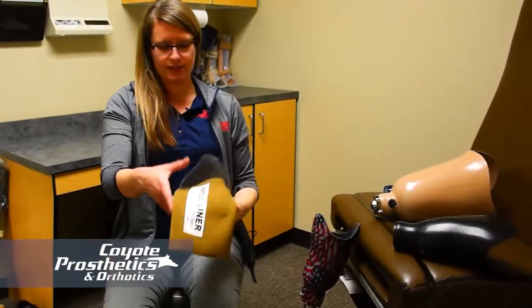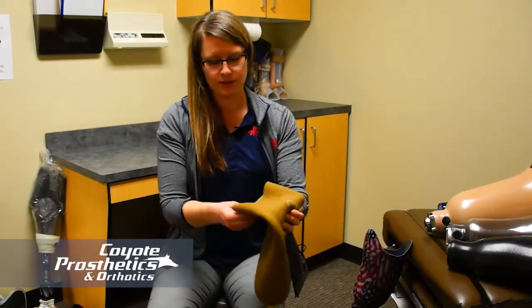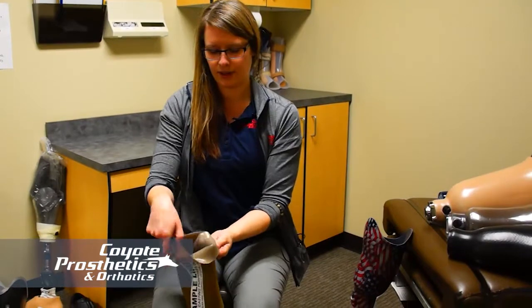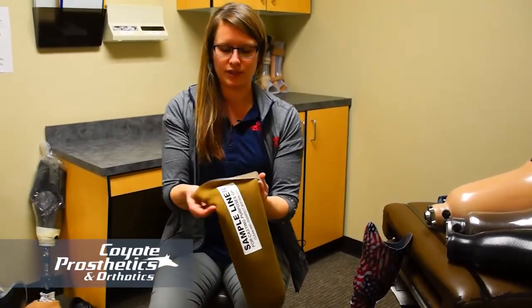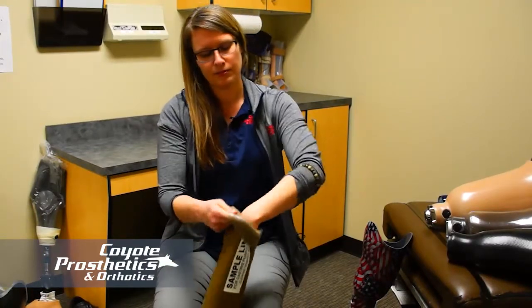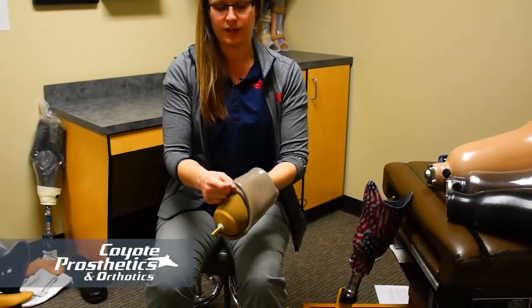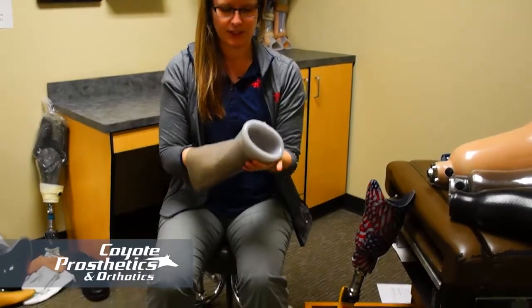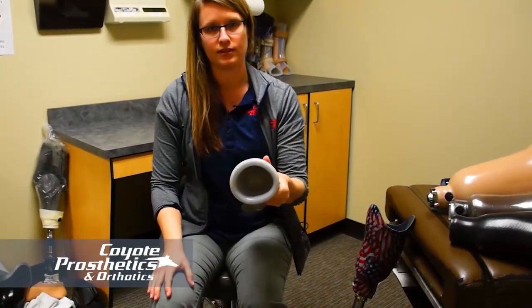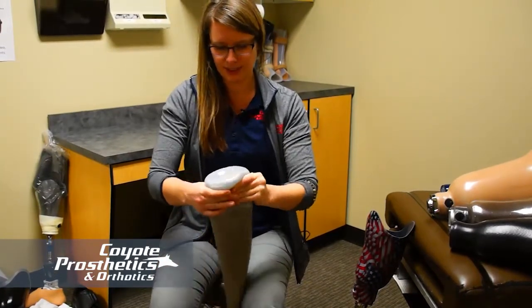First we are going to start with how to put your liner on. Most times you will have a prosthetic liner, and that's what this is called. They come in all different colors, there are different types. But generally what you're going to want to do is turn this inside out. You want to turn this all the way inside out. Here, you can see there's just a little bit on the end. You want to make sure that you get completely to the end.